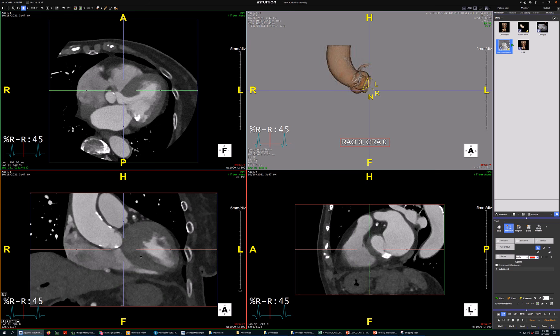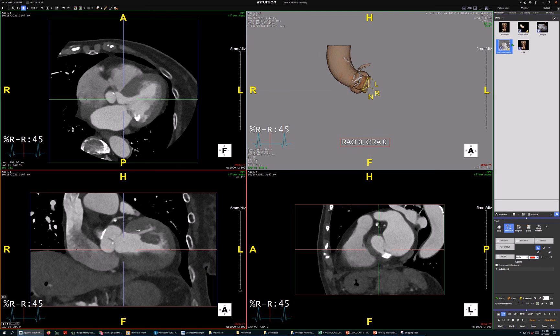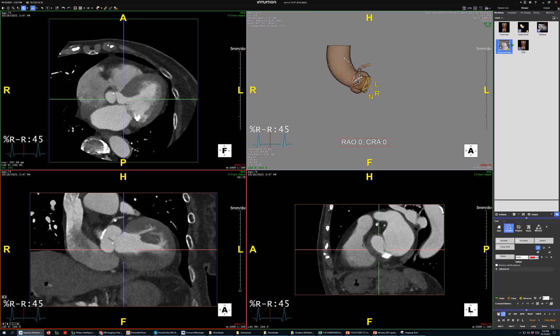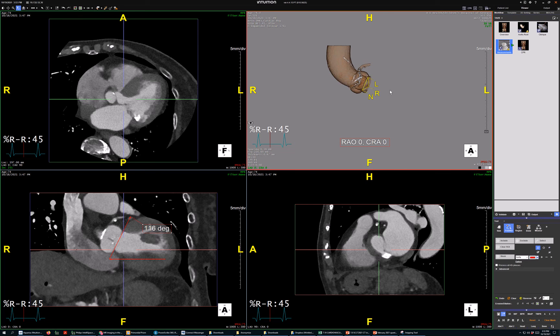There's this measurement they call the aorto-ventricular angle, but it's not really one relative to another because we're measuring it off this coronal image by convention. It's not a true measurement of the middle of the lumen of the left ventricle versus the middle of the lumen of the aortic root — it's just an approximation. One other thing I forgot: find the two-cusp view, which is where we overlay the right and left cusps. And that's this picture. Now we really are done — it just takes a long time to talk through it.